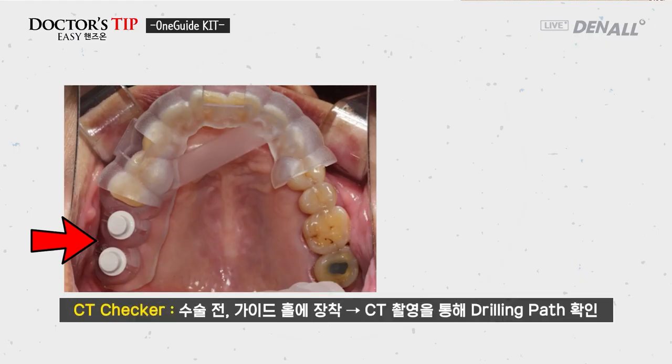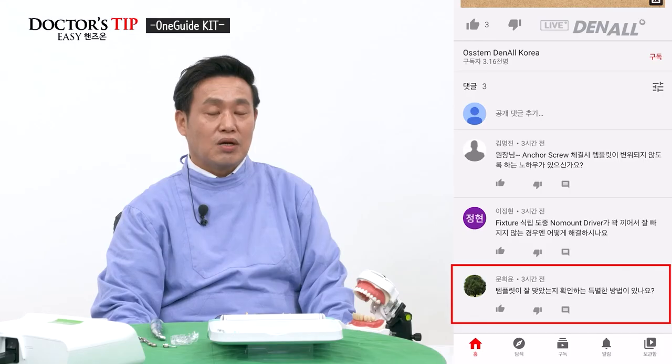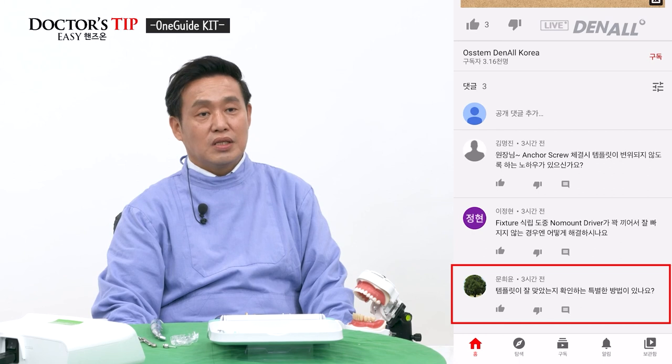You check using this on the drill hole and take CT, and you look at the template position and checker in order to see whether the fixture is placed in the intended area and drill hole is formed. You can use CT for this. In this way, you'll be able to check whether the template and the results are as was intended.